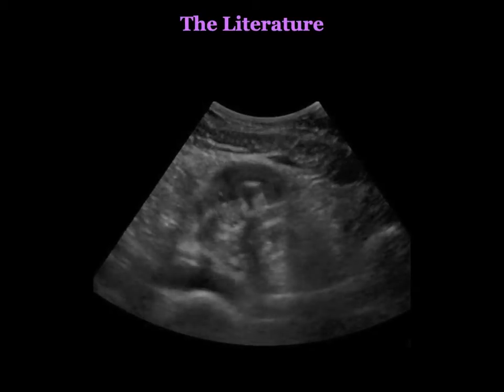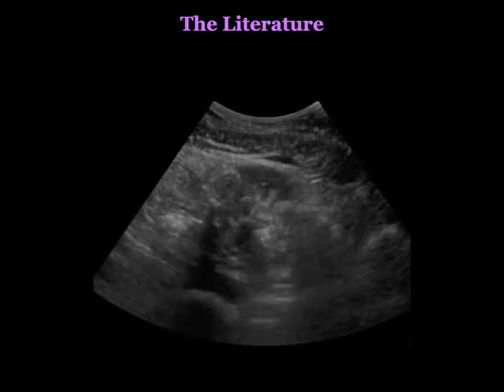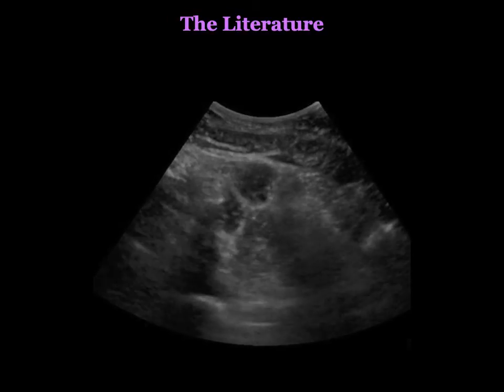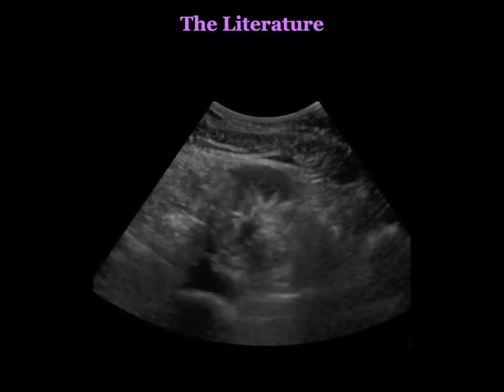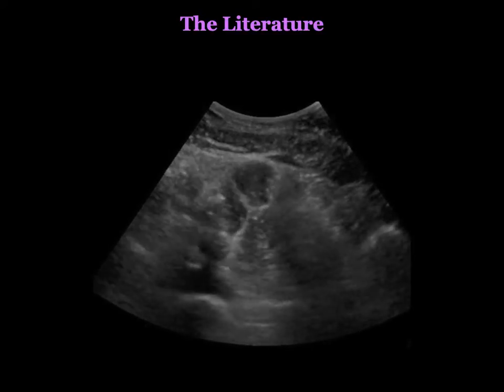So let's talk briefly about the literature behind the use of ultrasound to make the diagnosis of a small bowel obstruction. We should note that the majority of these studies have actually been performed in Europe, Asia, and Africa, where ultrasound is much more prevalent than in the United States.